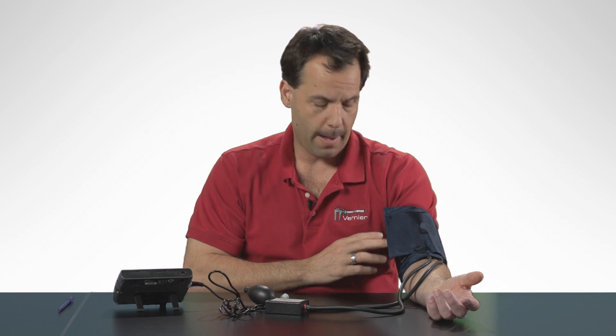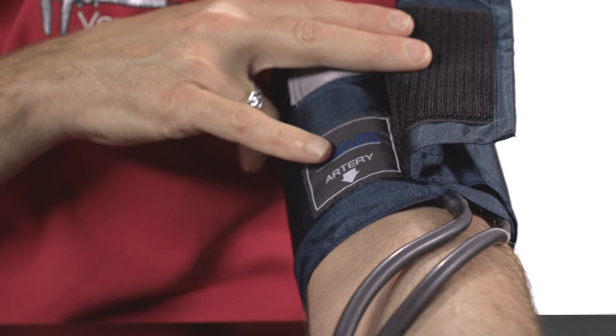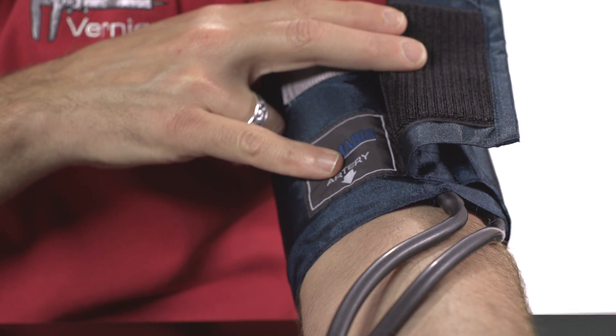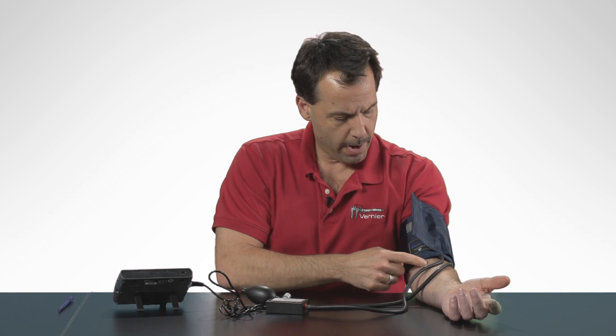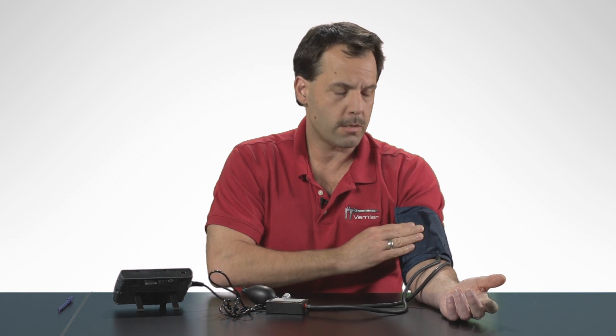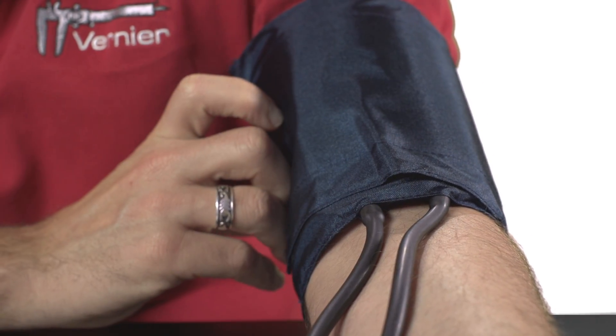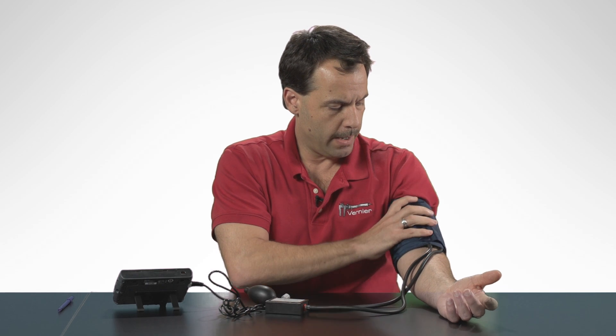Now that I've placed the blood pressure cuff on my arm, I just want to show you a few things. If I lift this little flap, you can see right here where it says 'artery.' This arrow normally should be right over the brachial artery, which is located right around in here. It's not critical that it's placed directly over the artery to get good data — you can also get good data if these two tubes are just placed in the crease of the elbow.